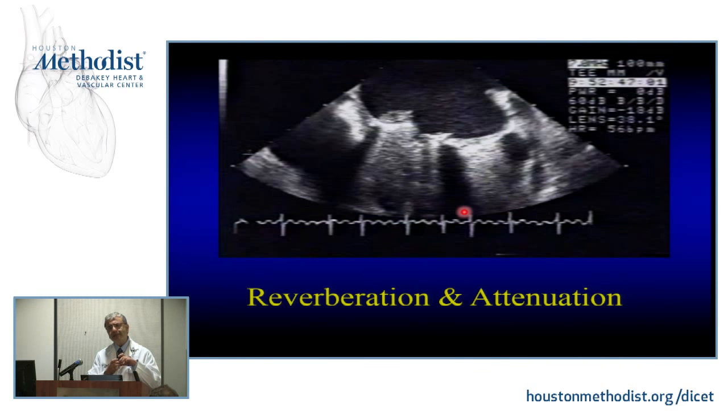I'm looking at a prosthetic aortic valve, okay? Transthoracic, my best view of any leak in this prosthetic valve is in the anterior position of this prosthesis. Posteriorly, it gets attenuated. I come transesophageal, my best view of any leaks, actually the structure of the leak as opposed to the jet that maybe I can interrogate later, is posterior, right, and less anterior. So this is why you see and you read in the guideline, and hopefully also you understand, that I need actually these two modalities complement each other because of the limitations of ultrasound.